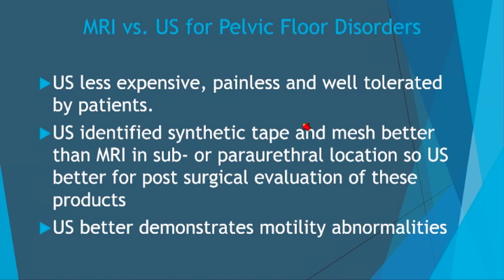Well, finally, I'd like to discuss the role of MR versus ultrasound in pelvic floor disorders. All of us know that ultrasound is less expensive, painless, and very well tolerated. I mean, we don't have to worry about patients having claustrophobia. Ultrasound, furthermore, is excellent in identifying synthetic materials, much better than MR. MR studies which have been done in vivo show that these materials are very difficult to identify.